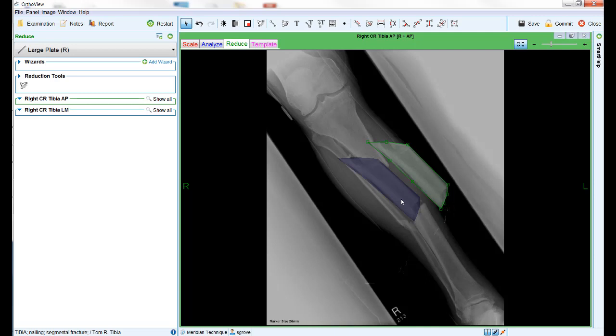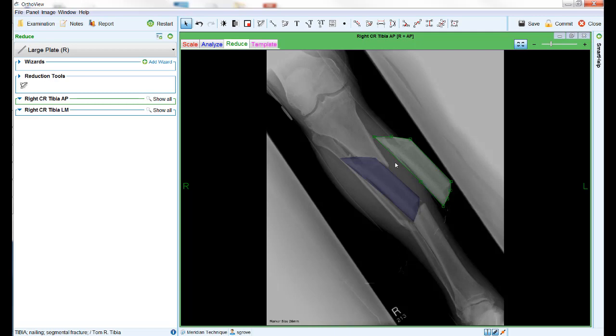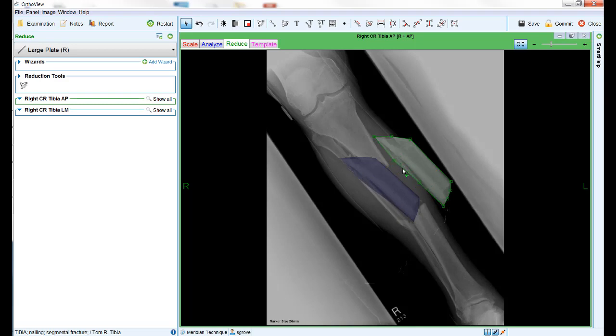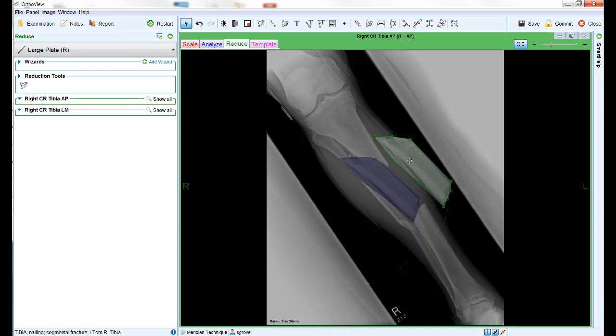As you move an area around on the screen, you will see that the original image is left shaded, allowing you to trace over the same area multiple times if required. As well as repositioning the selected area, you can also modify the outline. Left click and hold down the mouse button to drag each point to where you want it to be. A single left click on an existing point will remove the point, and a single left click on a section of line will add a new point. You can also left click and hold down the mouse button on a line to move that line. Finally, the whole outlined area can be deleted by pressing the delete key on the keyboard, having first left clicked inside the required area to select it. Right clicking inside the area causes a pop-up menu to be displayed from which a number of parameters can be modified.